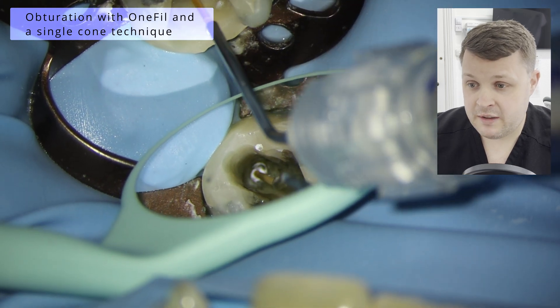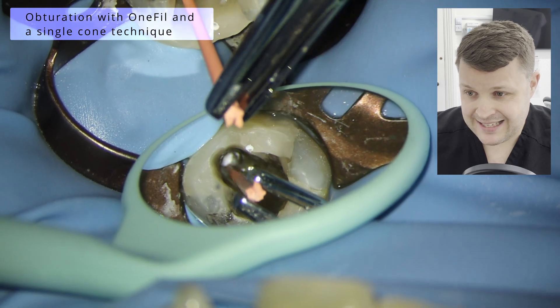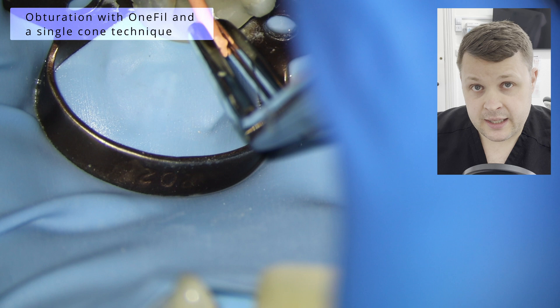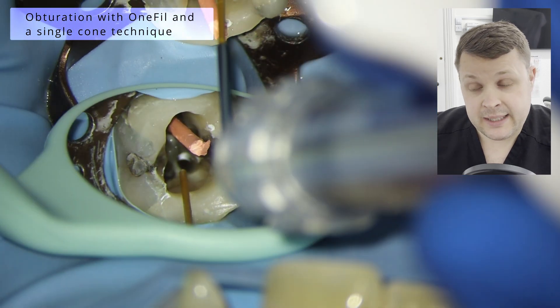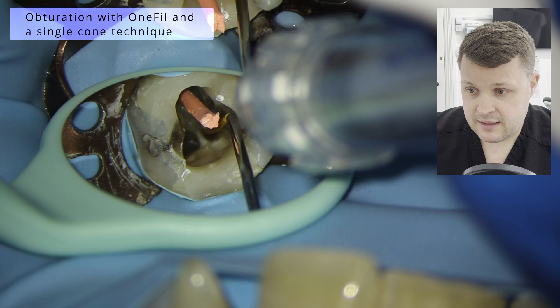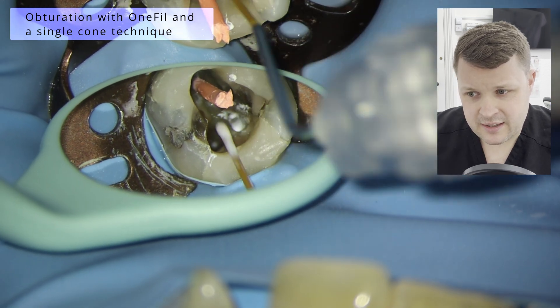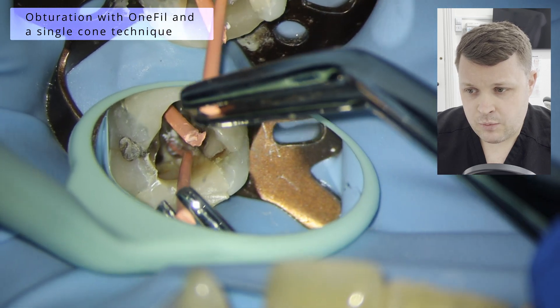Then we're going to use this bioceramic sealer — one fill with these visco tips. I know that the distal canal is massive, so I'm going to put probably a little bit more bioceramic in the distal canal than I would with the mesiolingual or mesobuccal canal. Unusually in this case, I'm not removing the excess GP points like I would — usually I like to do each canal and then get that boxed off and move on to the next canal, but it's kind of how you're feeling on the day.